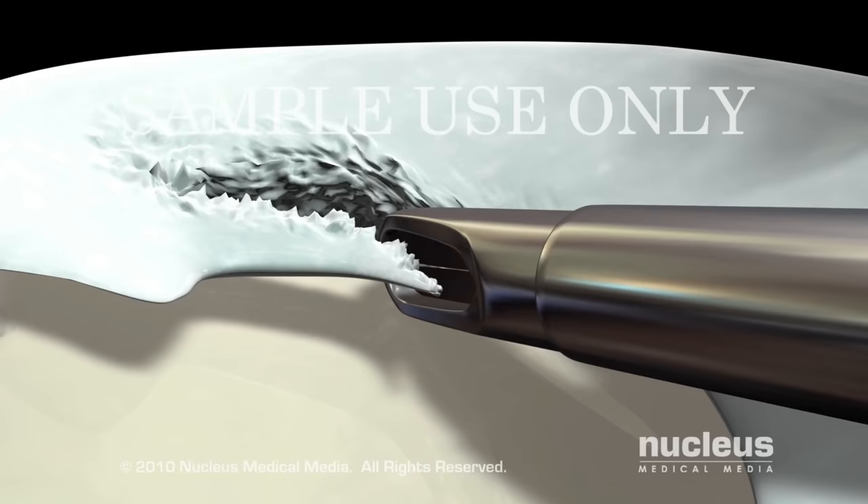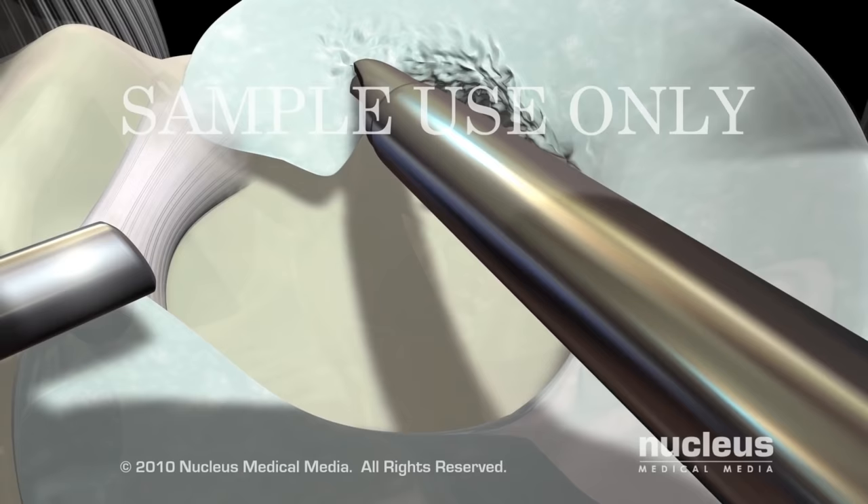While it may be possible to repair the meniscus with small stitches, in most cases the damaged portion must be removed.